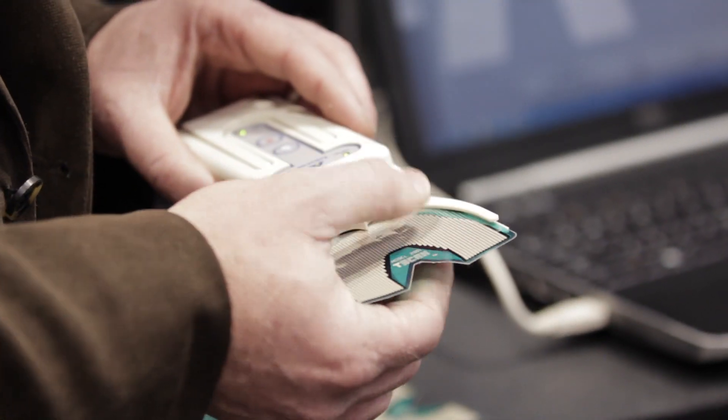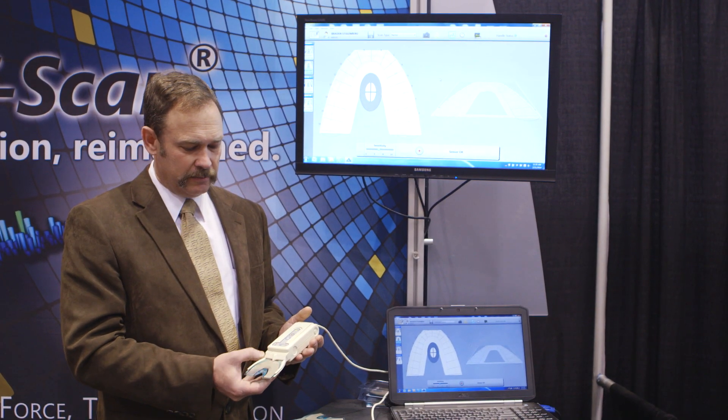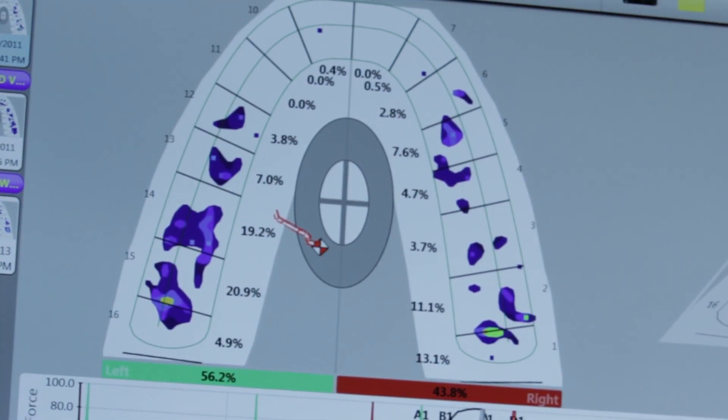The product is a sensor that you place in the patient's mouth and have them bite on it. Instantly you see on the screen where their pressure points are, what tooth hits first. It's a real-time showing of what's going on with their bite. It's customizable — you can change the shape and size of the teeth in the computer program so you're really accurate on where their contacts are.